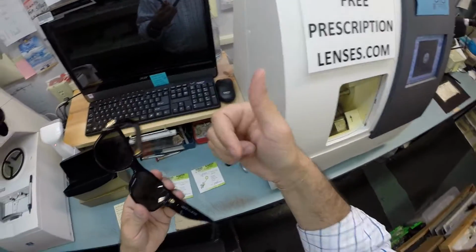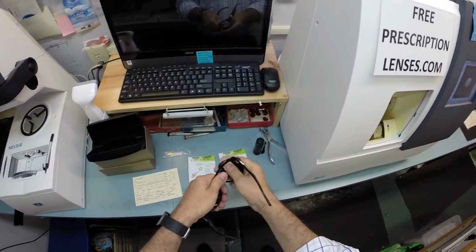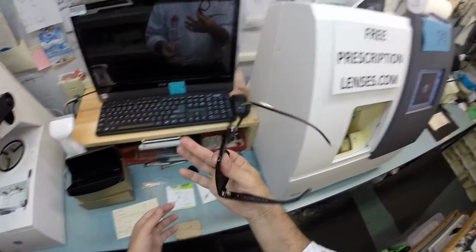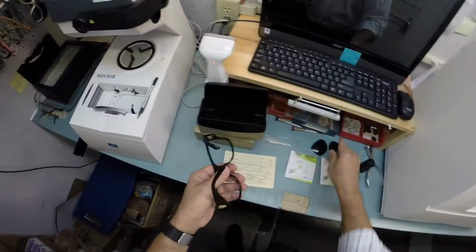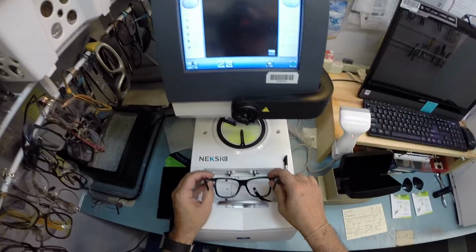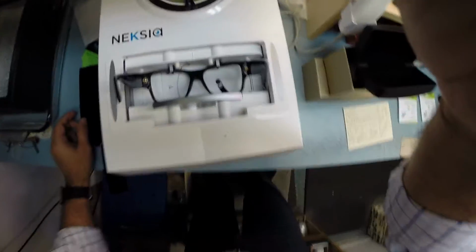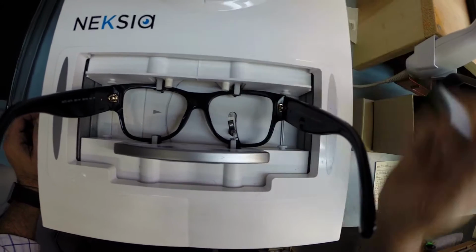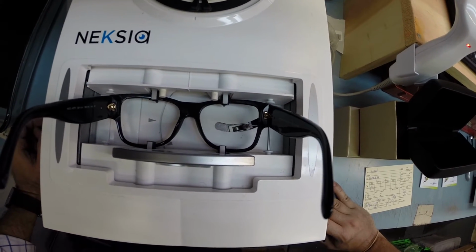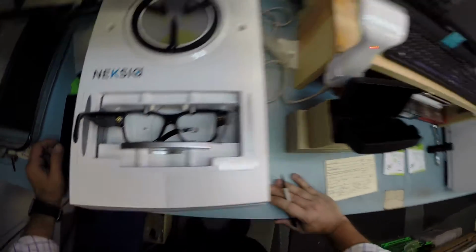Now, to take the lenses out, put the thumb at the nose, grab the lens by the other side, and just push downward. Out they come. Same thing on this side. Thumb at the nose, put the other thumb on top, push downward. Out it comes. I'm going to take your frame, put it into the tracing element of my edger, and hit start. A little stylus is going to pop up right here, and it's going to go around and trace the inside of the inside bevel of the right side of the frame before doing the same thing on the left.